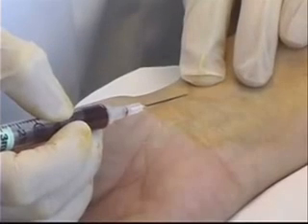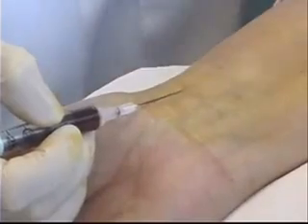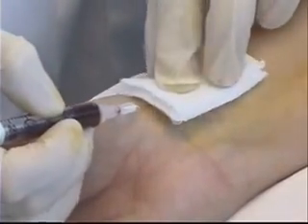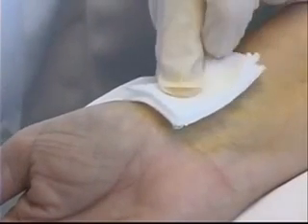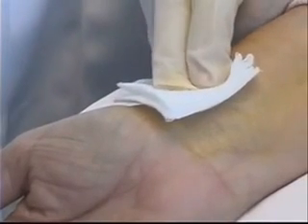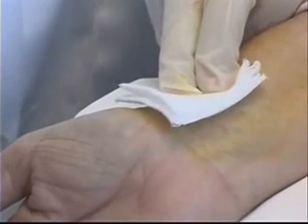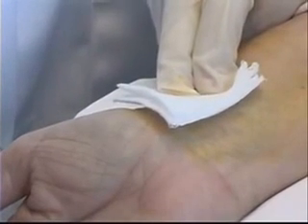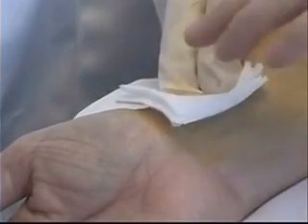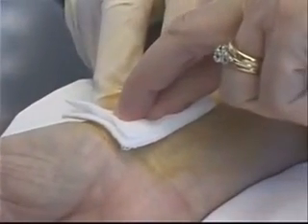Once I've obtained an adequate blood sample of one and a half to two cc's, I'm going to cover the area with my 2x2 gauze and very quickly pull the needle out of the skin. I can then either apply pressure myself for approximately five minutes — or double that to ten minutes if the patient is on anticoagulant therapy — or if my patient is cooperative, I can ask her to please apply some pressure over that area until I return.